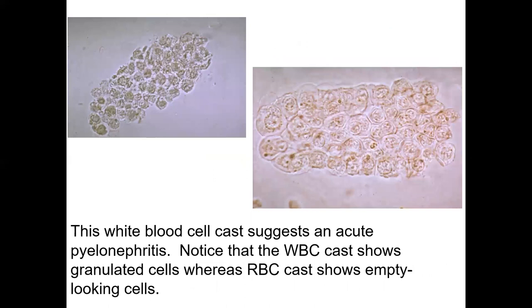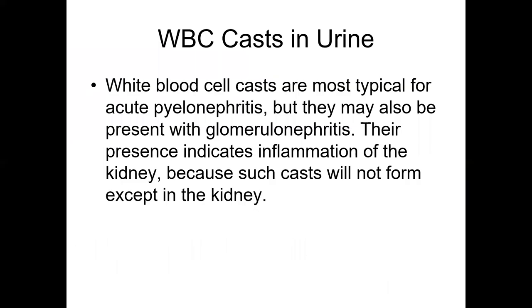This is a white blood cell cast — you see a group of cells within a kind of membrane in the microscopic view of the urine. That's a white blood cell cast, which can be seen in pyelonephritis or glomerulonephritis secondary to infections, because bacteria can bring on the neutrophils — PMNs, like we discussed in the case of glomerulonephritis.